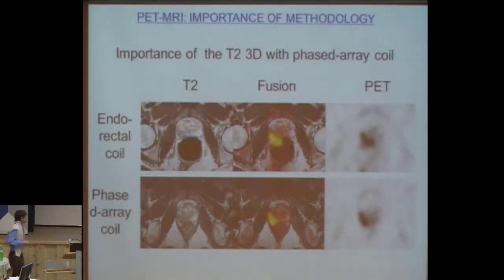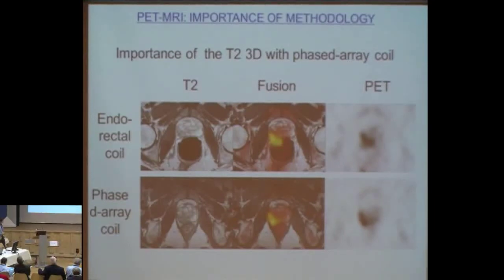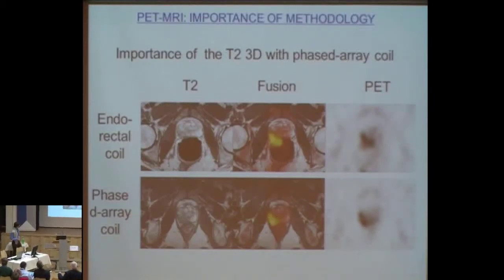Methodology is important. What we found out is that if you try and fuse images with endorectal coil, here this is a T2 image, the classic one that your radiologist shows you with an endorectal coil. If you fuse the PET imaging on that, you see that the tumor, that is the activity of the tumor here that is proven by PET, impedes on the endorectal coil. So it has not proven to be efficient to fuse images with endorectal coils, whereas if you use the phase array coil and you work on 3-dimensional images, you have a much better fusion, much more precise fusion here. This is an example of here a tumor that in 3D shows up here and with its metabolic activity on PET. So methodology, of course, is quite important.